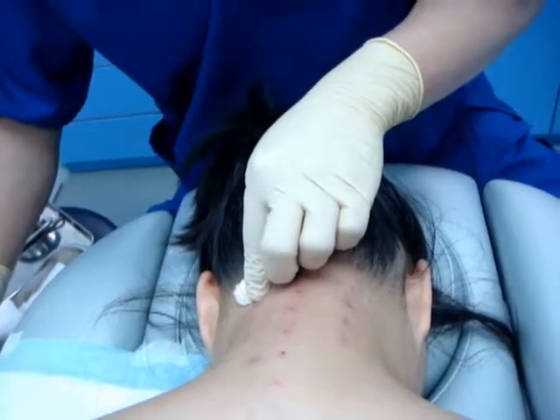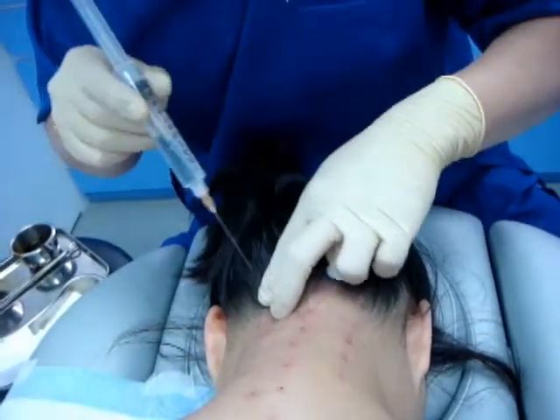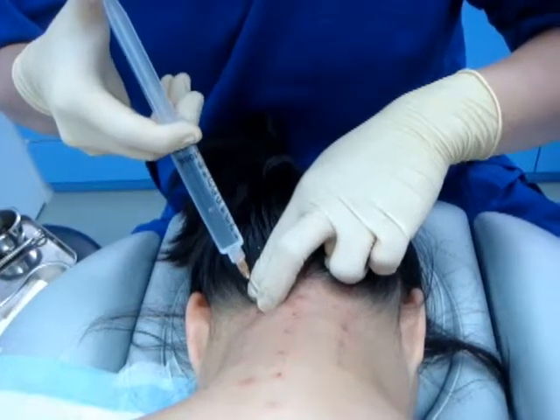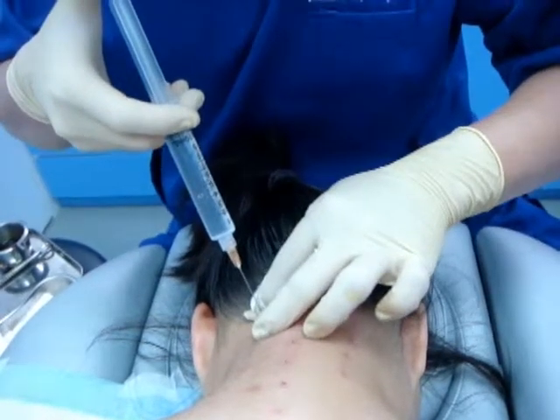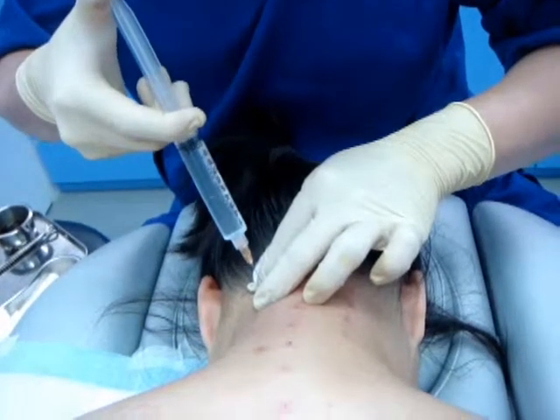Now we need to change to a longer needle because the facet joint is usually quite deep. This is a 25-gauge 2-inch needle. Right now I can touch the facet more easily. The technique is always: hit bone and inject. That is the facet.